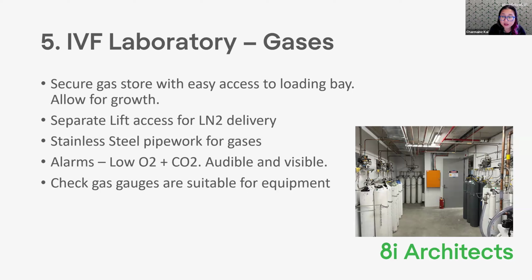And then the other thing is to also check your gas gauges are suitable for the equipment, particularly in the lab. We've had some issues recently where the gas gauges, the measurement of the amount of gas that's coming through, was a lot higher than what was required for the equipment. So it meant that you couldn't actually get a proper gauge of how much gas was going into the equipment. So something to be aware of.